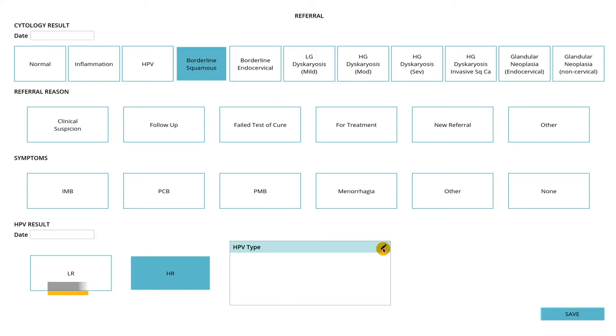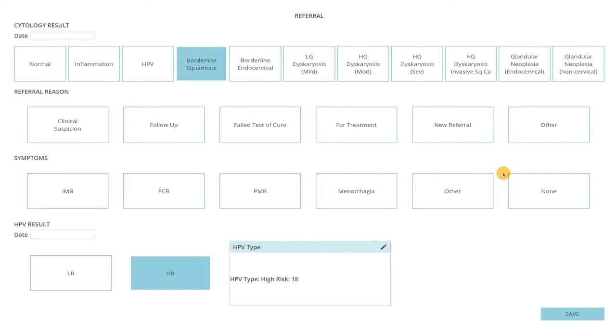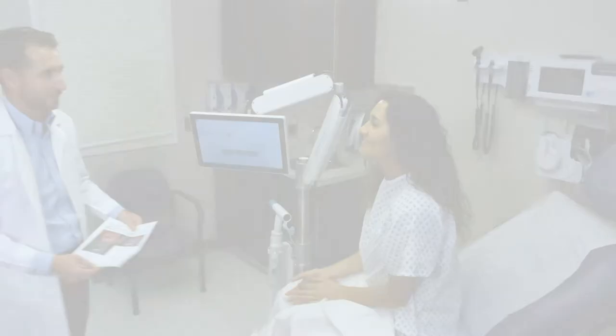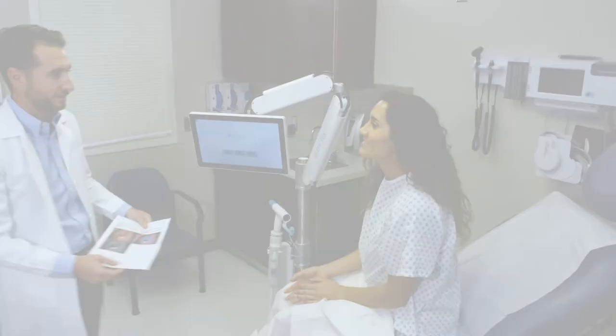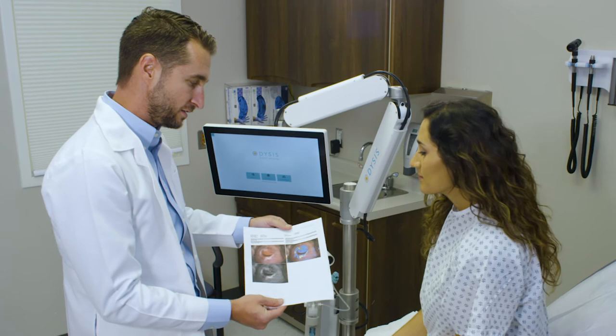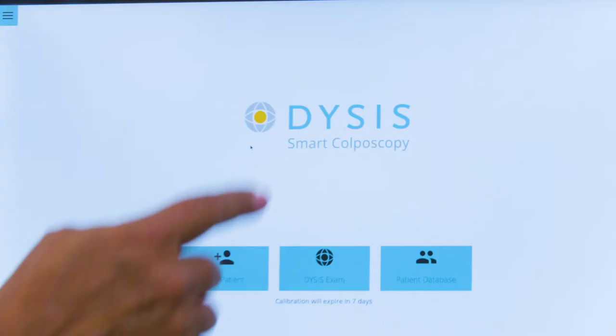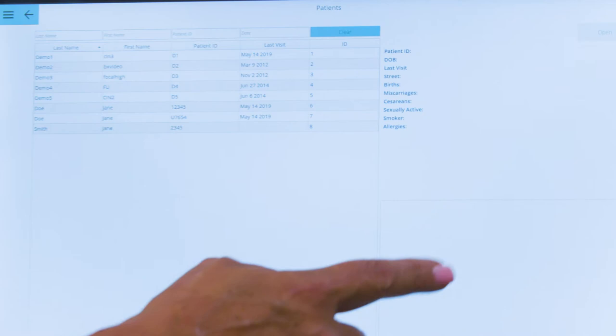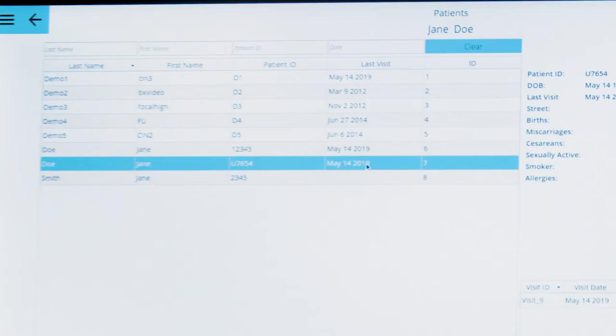Entering a new visit on an existing patient. If a patient has already had a Dysys Ultra colposcopy, additional visits can be added to an existing patient record. To add a visit, press Patient Database from the home screen and search by the first name, last name, ID number, or date of the last visit.